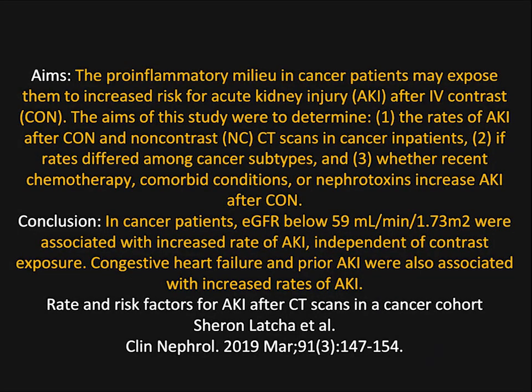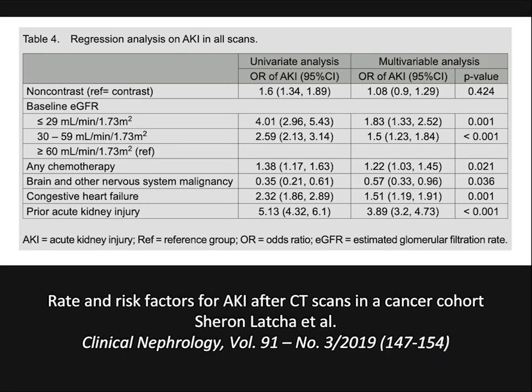An article by Lachi: cancer patients at GFR below 59 were associated with increased rate of kidney injury independent of contrast exposure. Congestive heart failure and prior kidney injury were also associated with increased rate of AKI. So again, just some more information and things you need to think about. And in their regression analysis, you can see some of the numbers for the various things. And again, obviously, risk becomes higher as your GFR decreases.